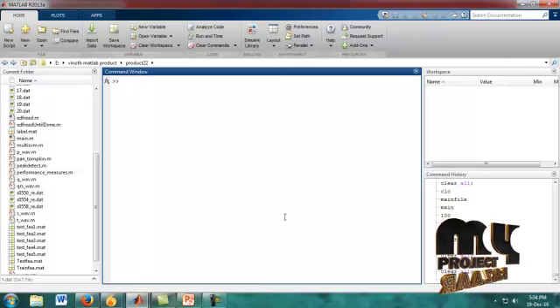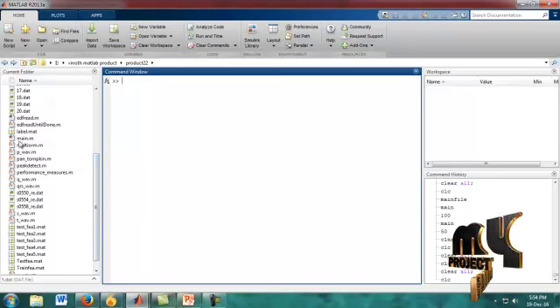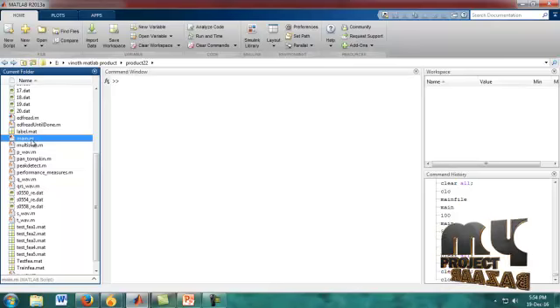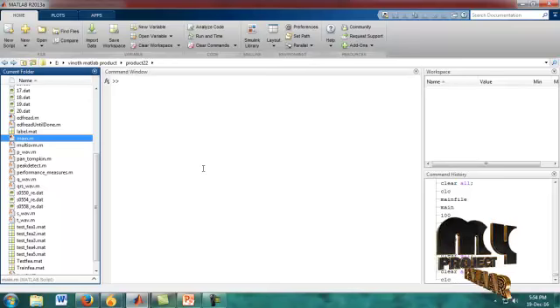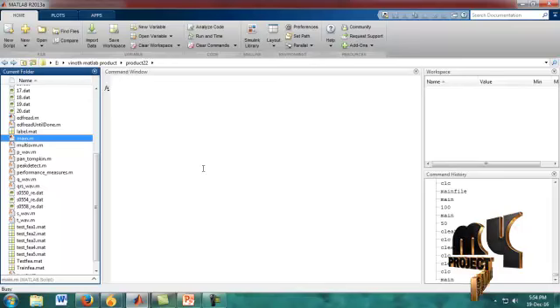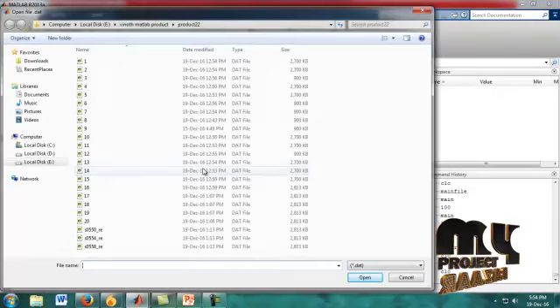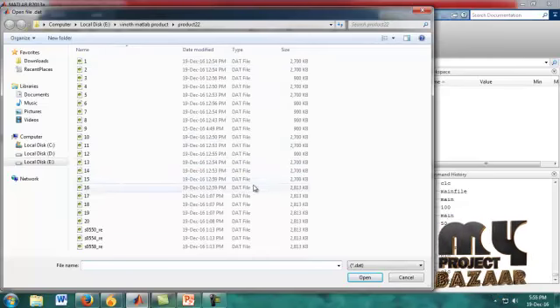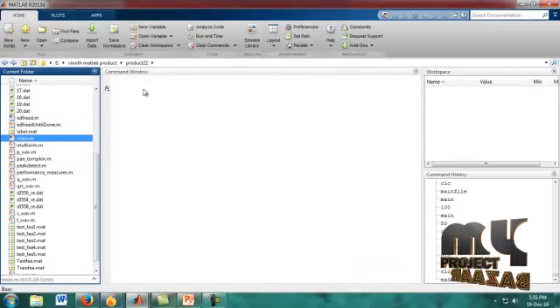The project source code file is run from the command window. In the current folder, the menu file is shown. We have to choose main.m. It is our source code file. So we have to run the main.m file. After running our source code file, we have to choose the signal. There are many types of signals in that. We have to choose any one of the signals.